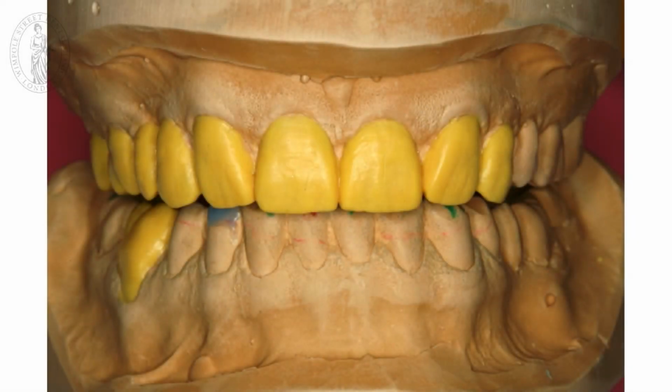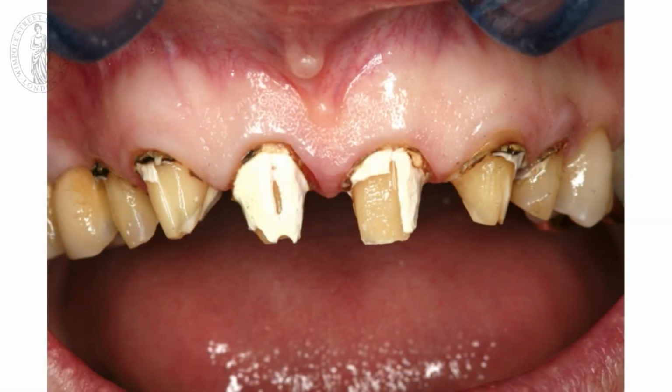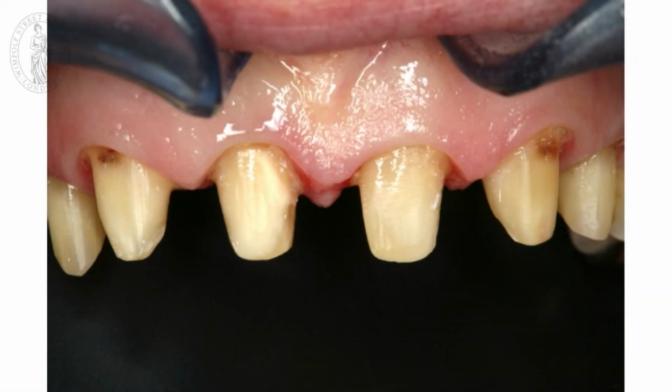So first step is always take impressions, get these impressions to the lab. They produce a so-called wax up, that means an imitation of how the teeth should look like at the end of our treatment. Then, as in the case before, we remove the bridge, remove the old cement rests, the old fillings, the decay, and restore the teeth to perfect health again. In case there's, for example, a periodontal disease, we do that as well. Then we re-prepare the teeth and take a proper impression.